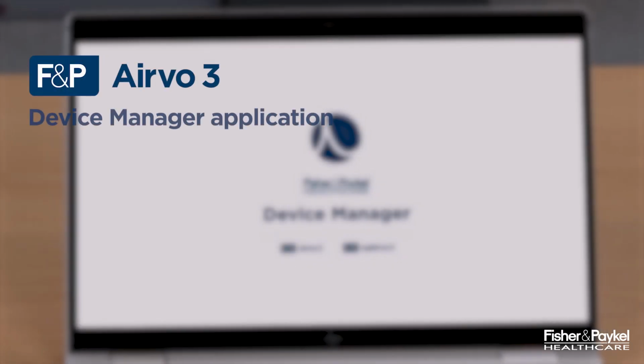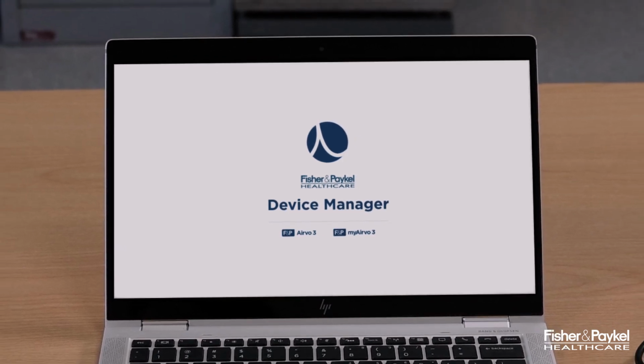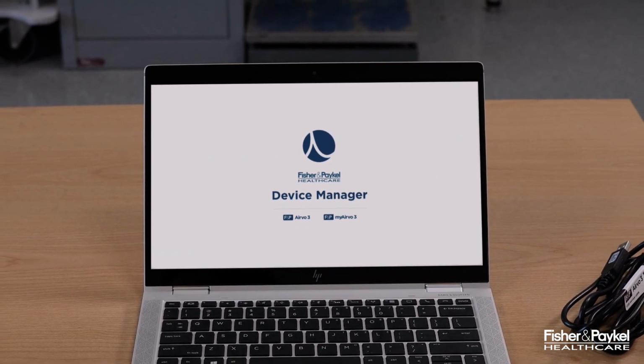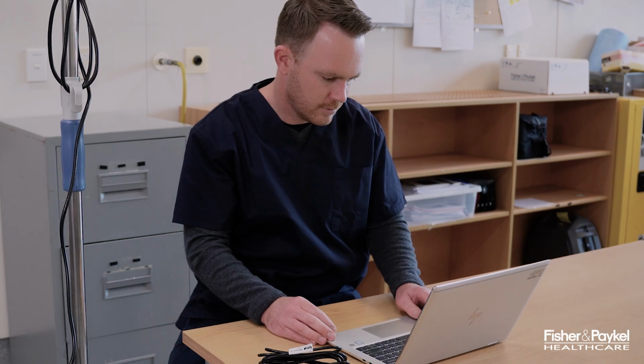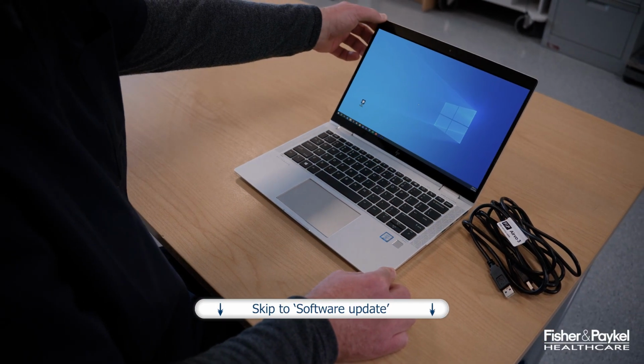The F&P Device Manager is an application that can be downloaded from F&P Services web platform. It allows you to check if the Airvo 3 device has the latest software and update if required. If you have already installed the Device Manager app, you can skip to the next chapter called Software Update.